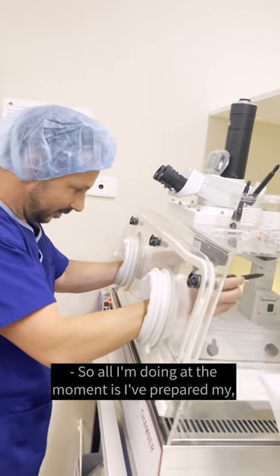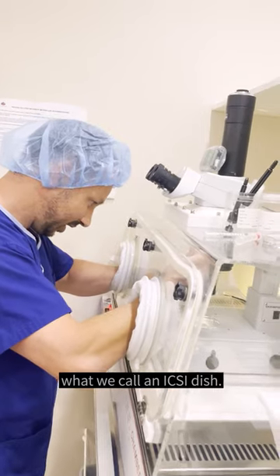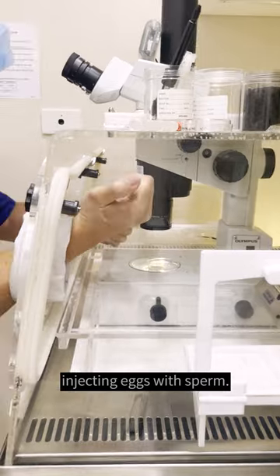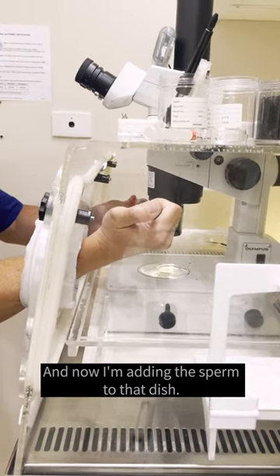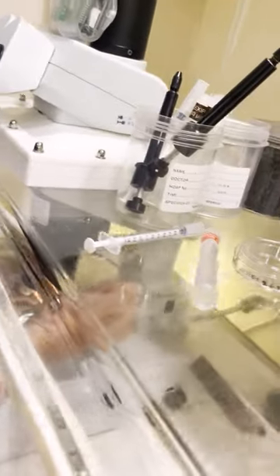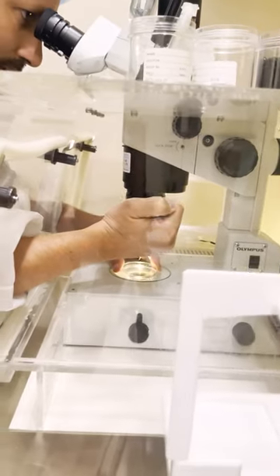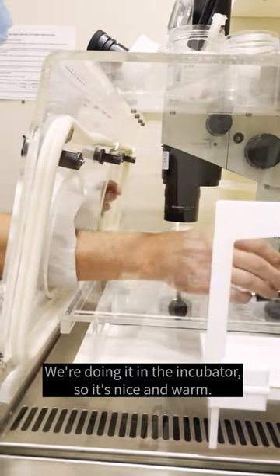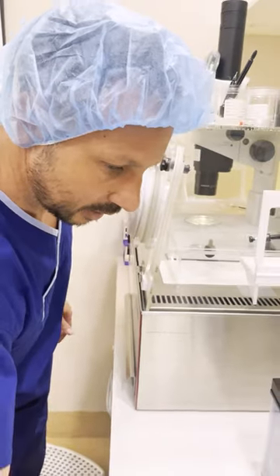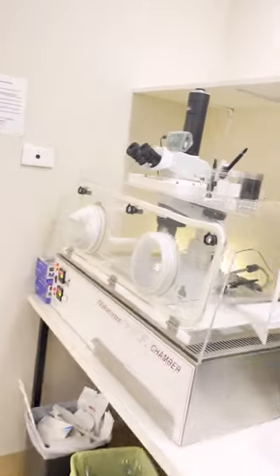So all I'm doing at the moment is I've prepared my what we call an ICSI dish. That's the dish where I'll be injecting eggs with sperm, and now I'm adding the sperm to that dish. We're doing it in the incubator so it's nice and warm — it's an IVF crib so it's heated and gassed. And so the sperm's in, and then I get my eggs, which is the second part.